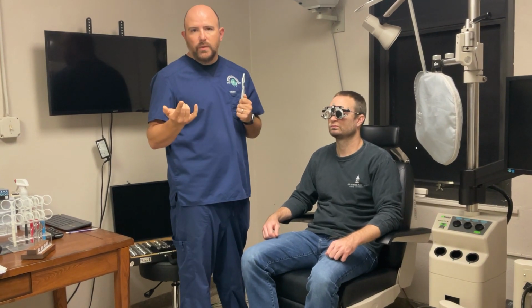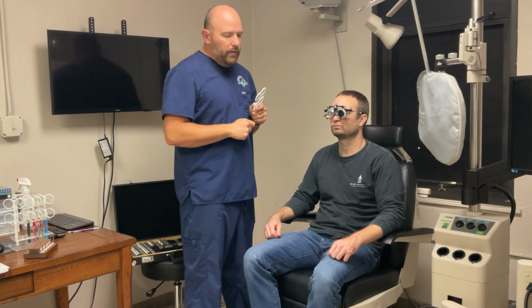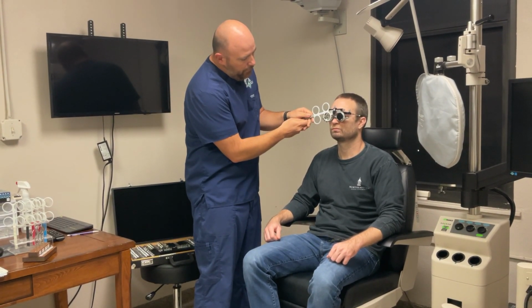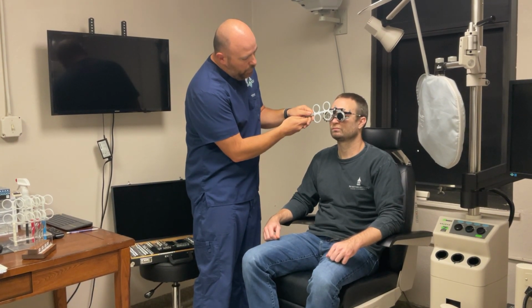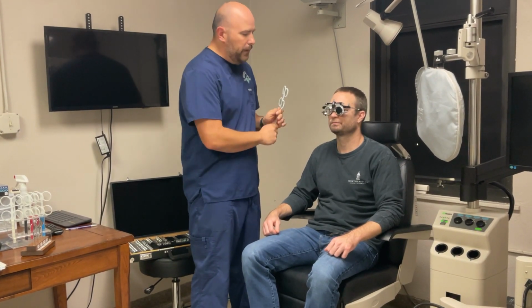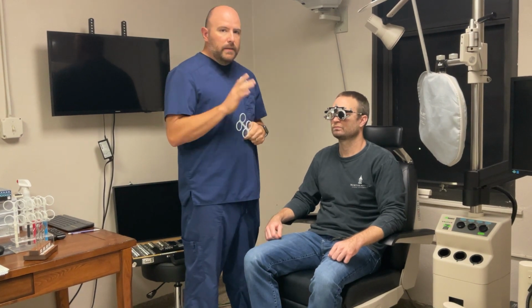They effectively will note neutrality with the 2 lenses. So still looking at the same line, NVSOK, and which choice looks clear here? 1 or 2 are about the same. Here's 1, here's 2. About the same. About the same, okay. And so in that instance, we're all the way finished, except for the last part where we're going to check VAs.